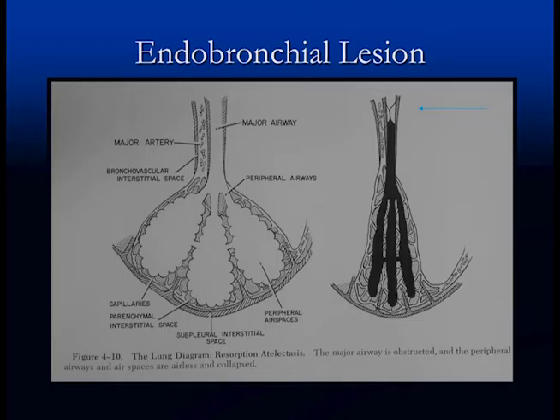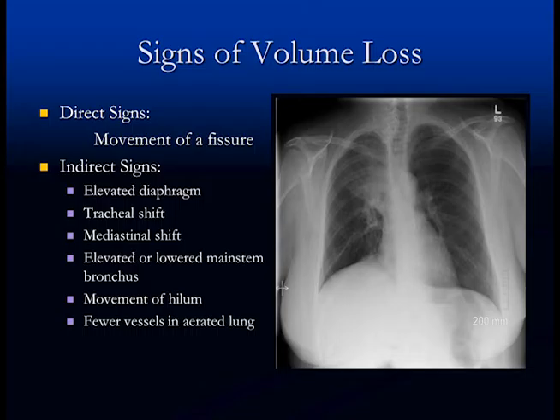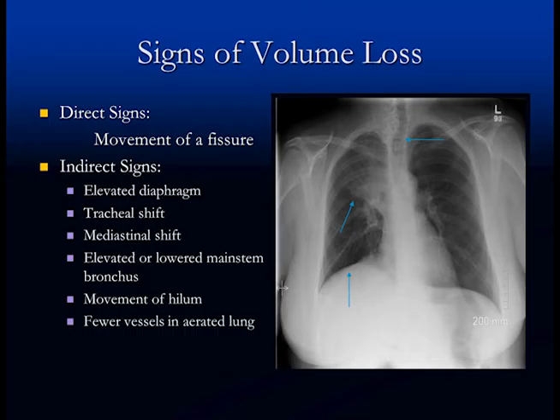There are different signs of volume loss to diagnose collapse. First, there's always consolidation — the whiteness in the lung. One direct sign of volume loss is movement of the fissure, which presents as a more or less straight line. Here the minor fissure has moved up because of collapse of the upper lobe. Indirect signs include an elevated diaphragm, higher than the other side, and tracheal or mediastinal shift towards the collapsed side. All of these are signs of volume loss.